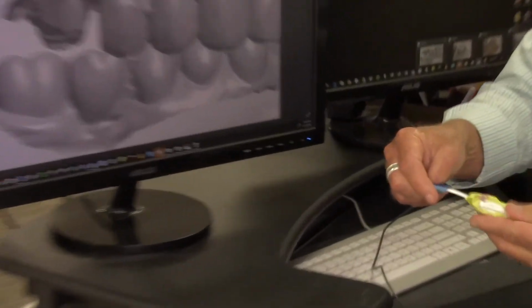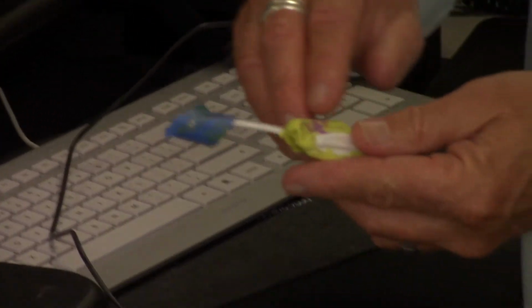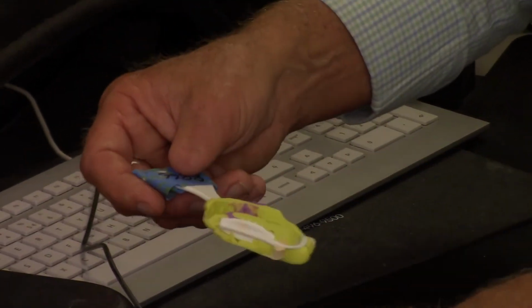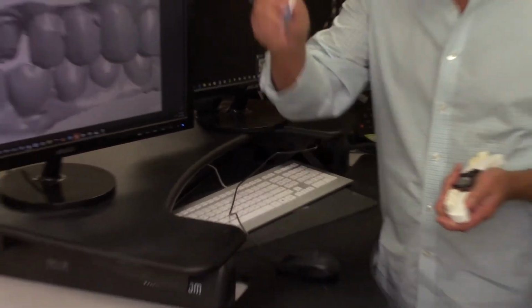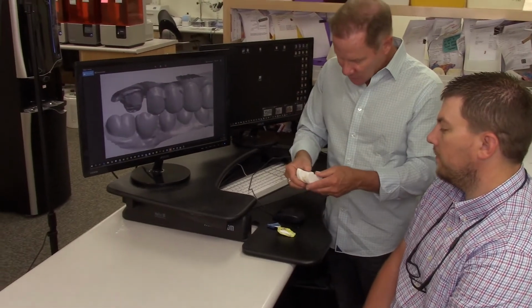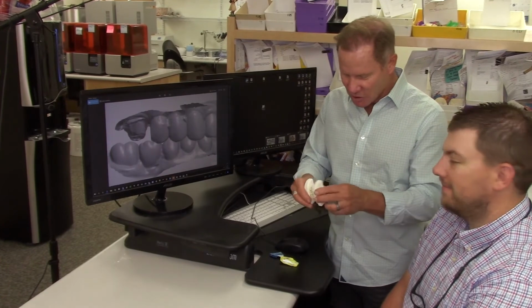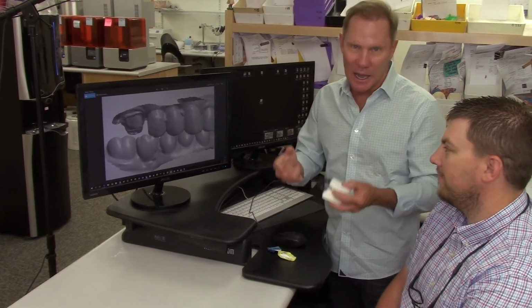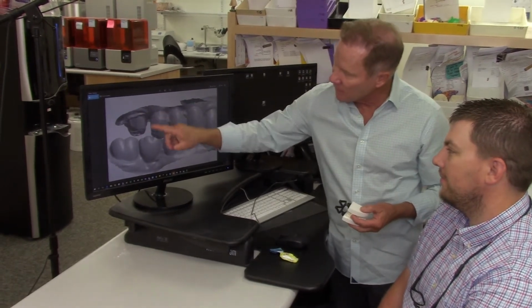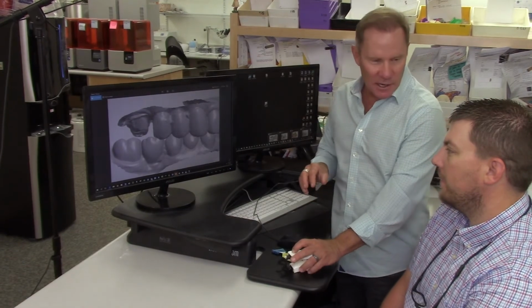We've got this flexibility. We only have one tooth, two teeth on one side and one tooth on the other side of that restored tooth. We don't know if that patient bit down accurately or not. If they didn't, and we don't really see that here, then we try to hand articulate this, but it doesn't always work, especially if there's some distortion, and that's when we get restorations that can be high and take time for you to put in. And again, most distal extension is the most important. So it's very exciting.